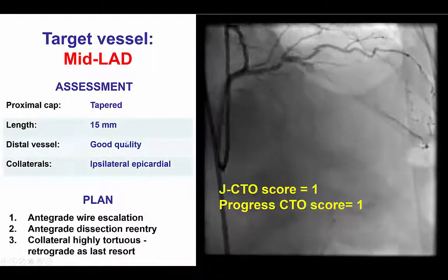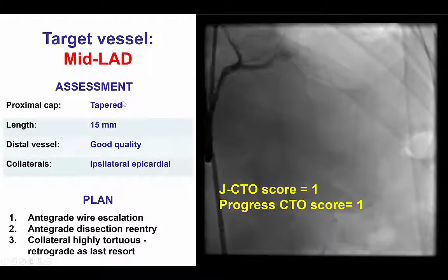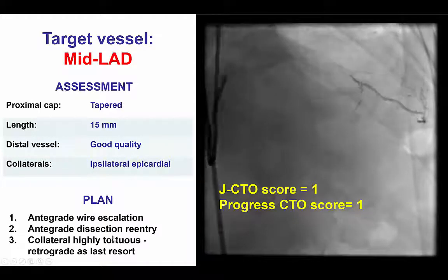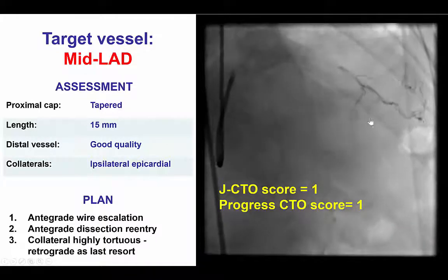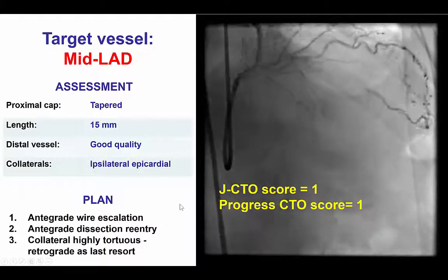In this particular case, the plan, given the favorable characteristics, was to start with antegrade wire escalation followed by antegrade dissection and re-entry, and not attempt the retrograde approach until there was no other option, because the collaterals did not appear appealing for retrograde crossing.